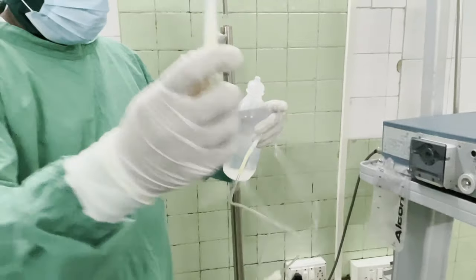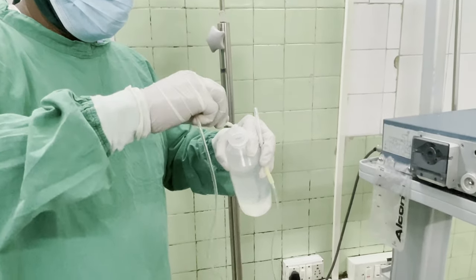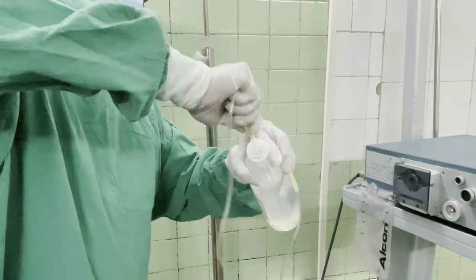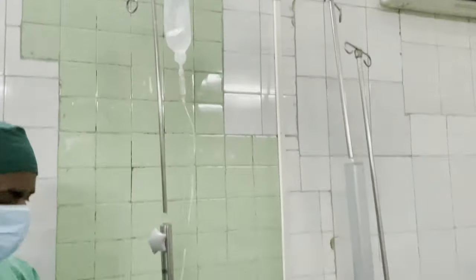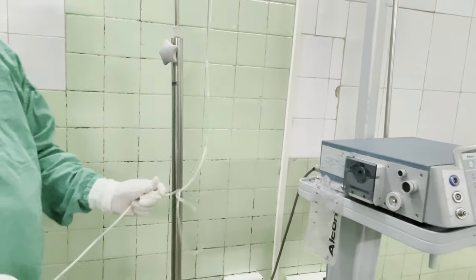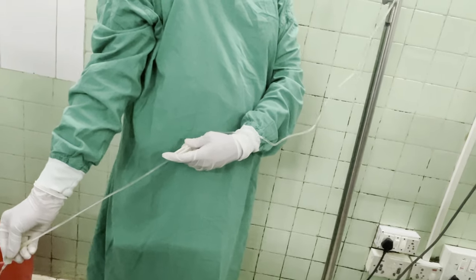One end of the IV set is introduced into the nozzle of the bottle. The bottle is now suspended from the IV stand. The other end of the tubing is held by the assistant. It is turned on and the fluid is allowed to completely fill up the IV tubing.